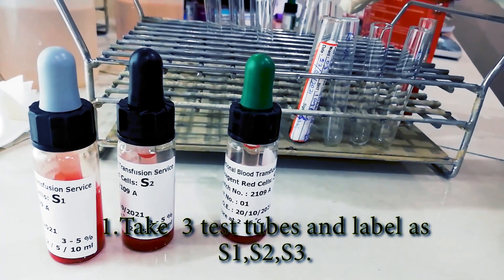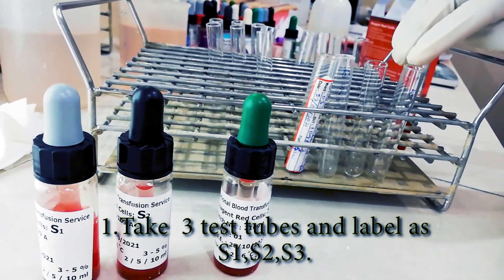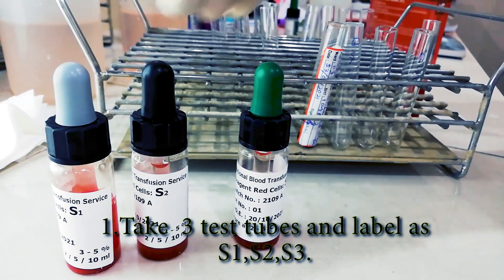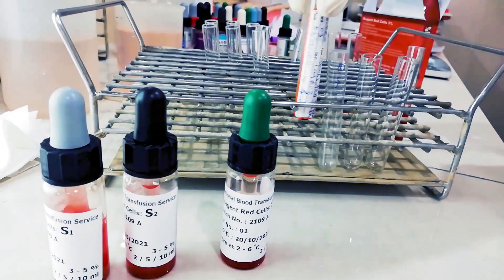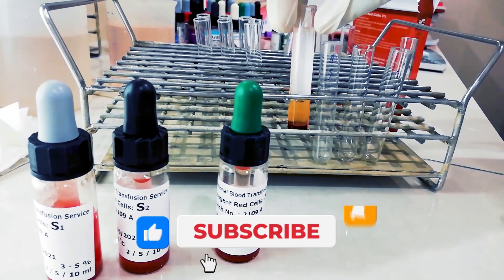We have to label the test tubes S1, S2, S3 and bring the reagents S1, S2, S3 into the tube to temperature. We have to have serum for the test, so we have to prepare serum from the blood.